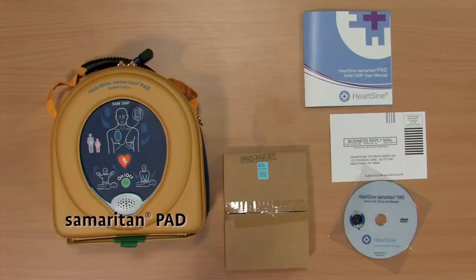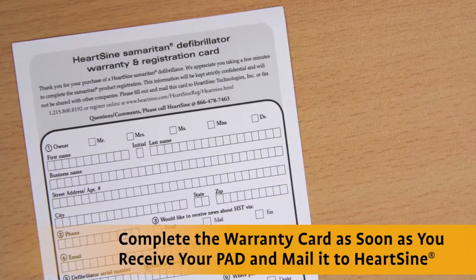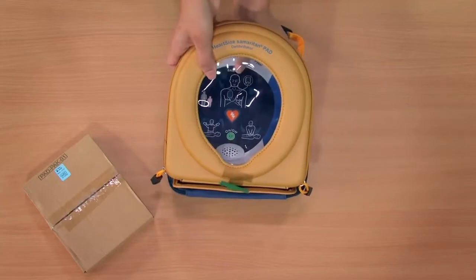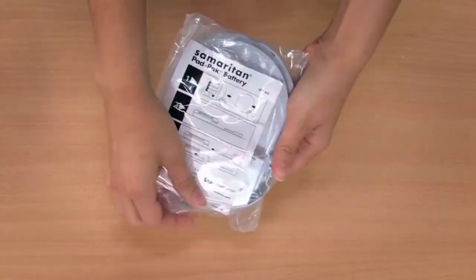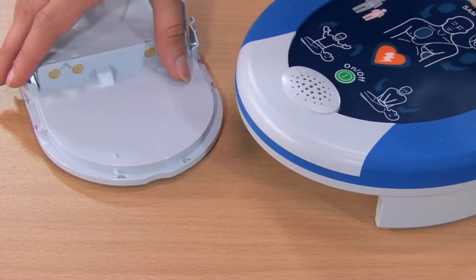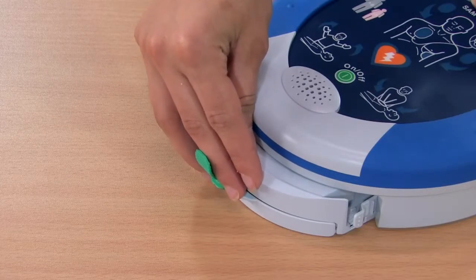To set up the HeartSign Samaritan PAD, simply open the box and remove all the components. Be sure to complete the enclosed warranty card and mail it into HeartSign to activate the 10-year warranty. Remove the PAD from the case, then open the packaging and remove the pad pack. Insert the pad pack into the underside of the PAD and slide it all the way to the back of the unit until you hear the pad pack click into place.